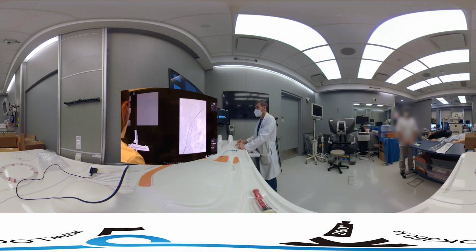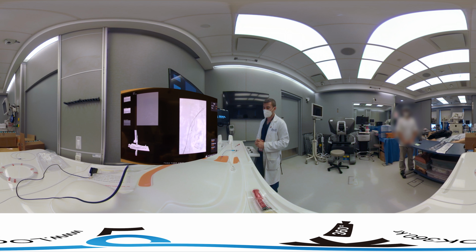All right, and now we can remove our microcatheter. You can do a final run through the base catheter if you wanted, and then unform this catheter to remove it. So what we'll do is we'll unform it right now. Over the micro, we'll pull everything back, and you can push it up actually if you wanted to remove it, or you can pull back to remove. And we're just going to pull everything out and finish.